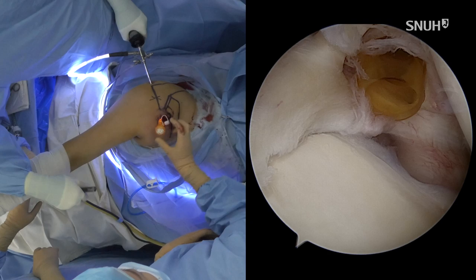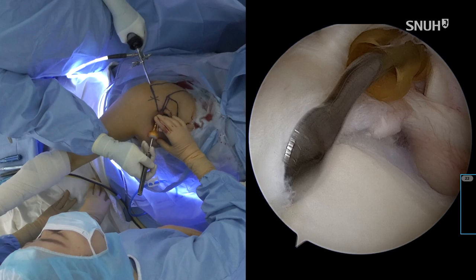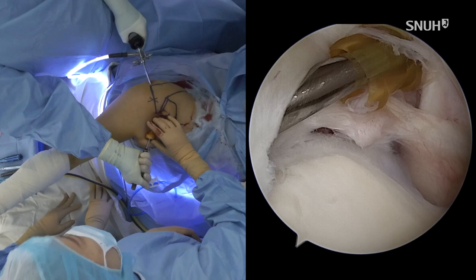Do not shave in a blind manner, okay? So some more of the cystic fluid is coming out by probing or decompressing with the elevators. I think the interruption of the negative checking valve system is achieved.